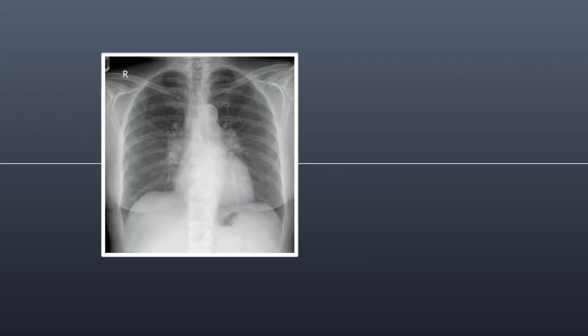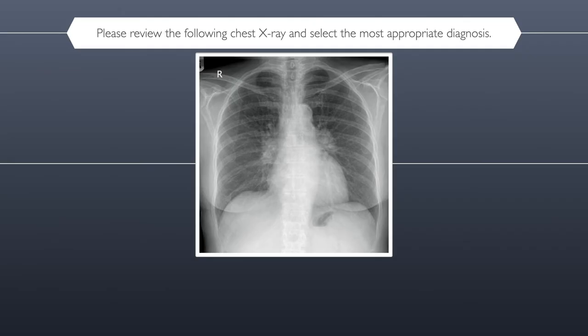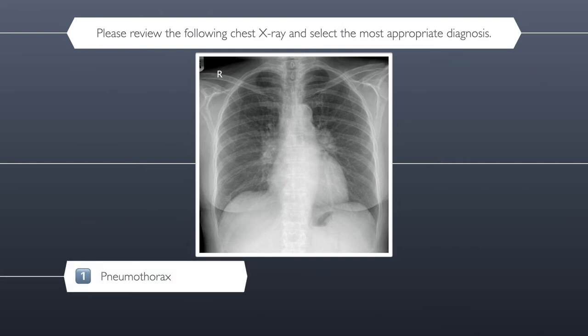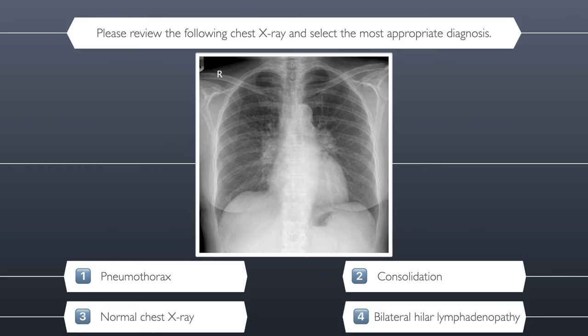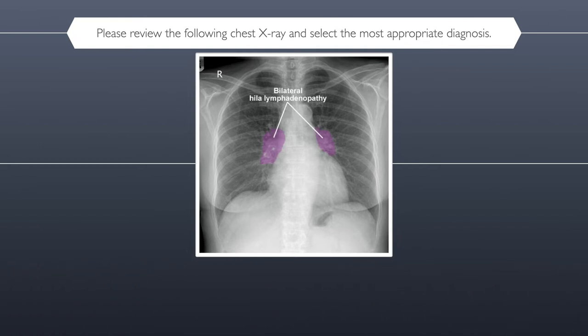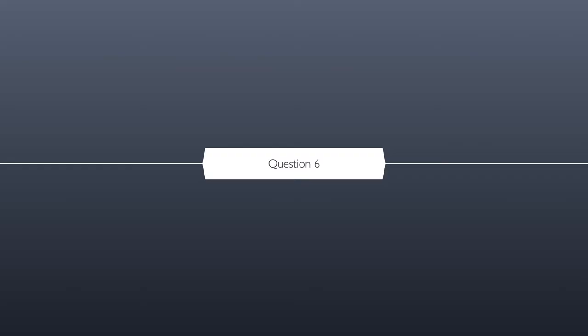Question five. Please review the following chest x-ray and select the most appropriate diagnosis. Here are your four possible answers: number one pneumothorax, number two consolidation, number three a normal chest x-ray, or number four bilateral hilar lymphadenopathy. The correct answer is bilateral hilar lymphadenopathy.